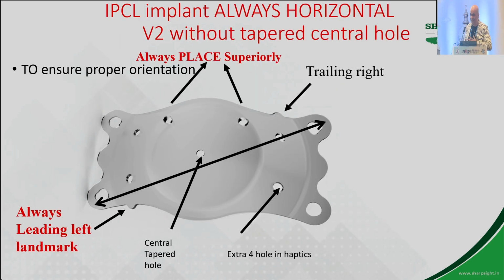Now let's look at the design first, since the topic says that. First of all, if you notice, there are 6 landing pads in the lens. So what this does for the patient is, if it's a toric lens, it's rock solid. If your workup is perfect, I have corrected up to 11 diopters of astigmatism with bang-on results in keratoconus and corneal scars, which means that this design works. There are 6 landing pads, which gives far better stability.